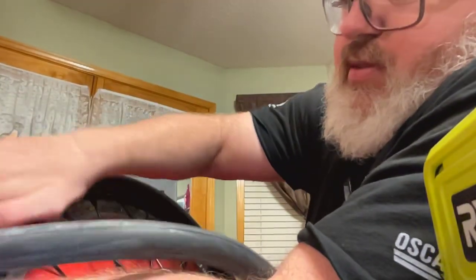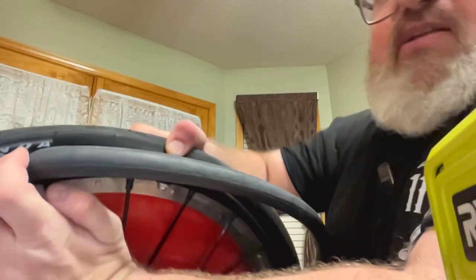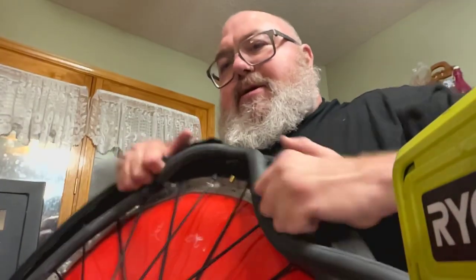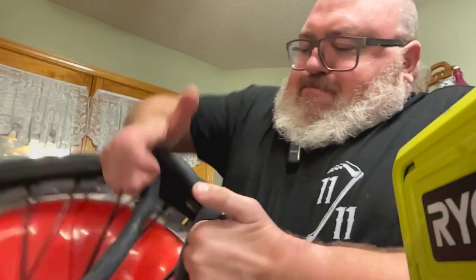So this is going to be hard for me to show just because of how I do it, but put the valve in, just give it kind of a push through. That tire's back behind the rim itself. Usually what I end up doing, let me get a little bit better, is I kind of push that valve back over and that tube over. That sits into the tire itself. And then I start working that tube into the tire.